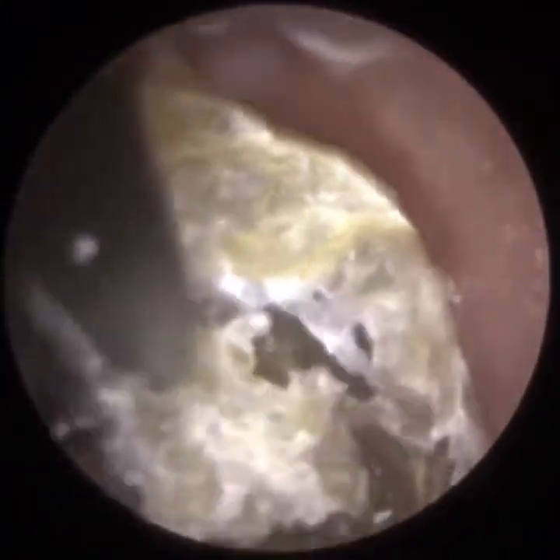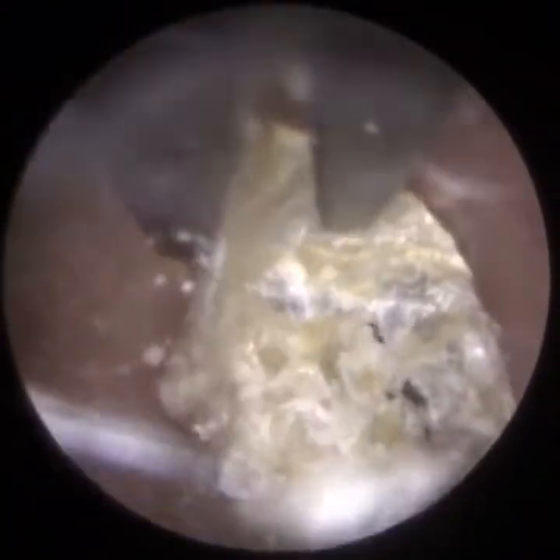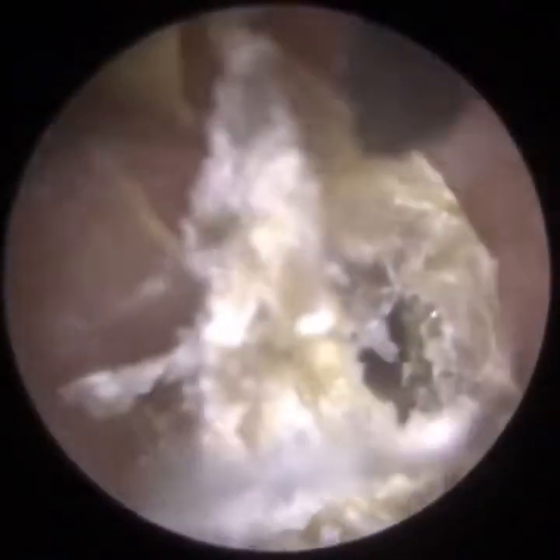Even though it's still a bit tricky to get in the correct grip because this dead skin was oriented in such a way, it's hard to get over the skin on both sides. So each side of the jaws of the forceps is either side of the dead skin layer. Can you see the bottom jaw is close to the posterior canal wall there. So just raise it upwards, trying to go down. There's a bit of skin that's facing towards me there.